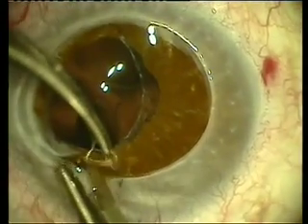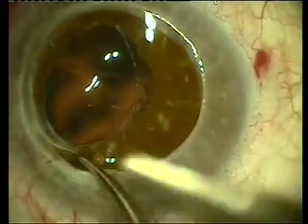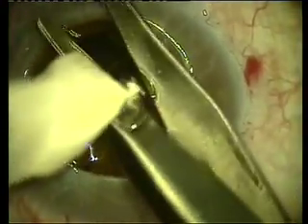As you can see here, there's significant synechiae between this haptic, the iris and the cornea, possibly contributing to the graft failure.